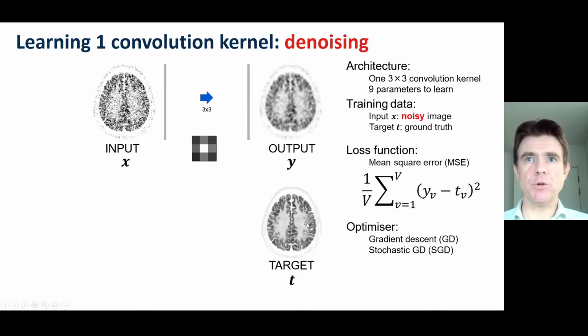And that's exactly what I'm showing here. You'll see that first of all it looks noisy, and then once we've done the optimization here, this was actually just a methodical search through all the values in this simple kernel. By doing that search, look at the difference. We've now found an optimized smoothing kernel which will take a noisy image and optimally smooth it, given just the limitations of that simple model, smooth it in the best possible way to get it to agree with the target.